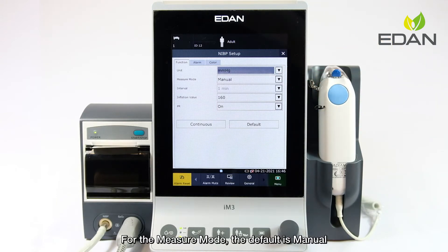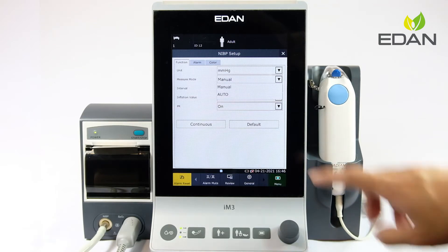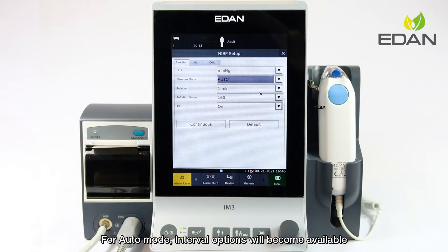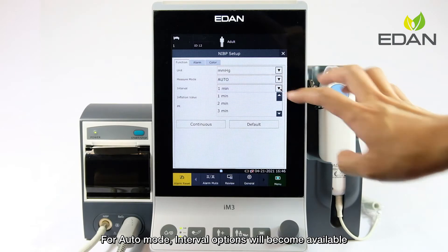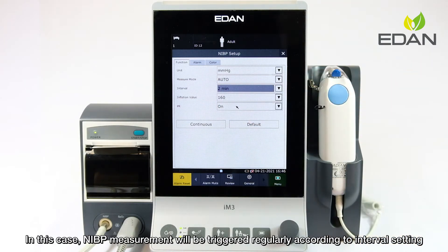For the measure mode, the default is manual, which means the NIBP measurement will only be immediately triggered from the NIBP button. For auto mode, interval options will become available, and the NIBP measurement will be triggered regularly according to the interval setting.